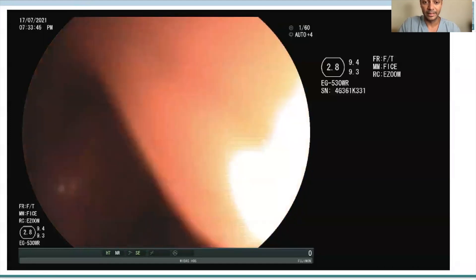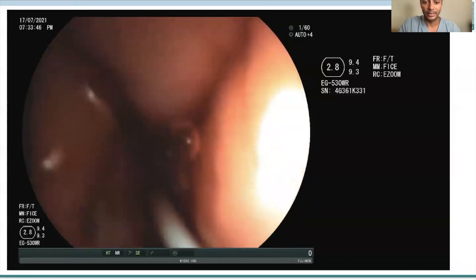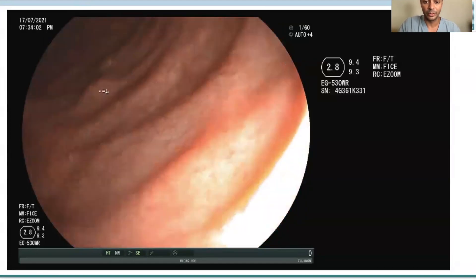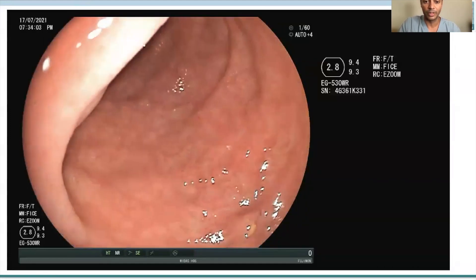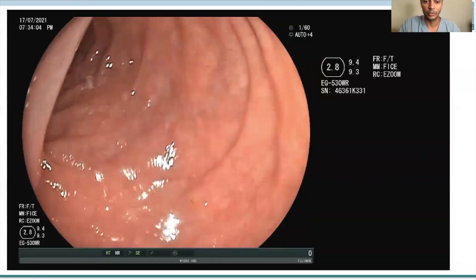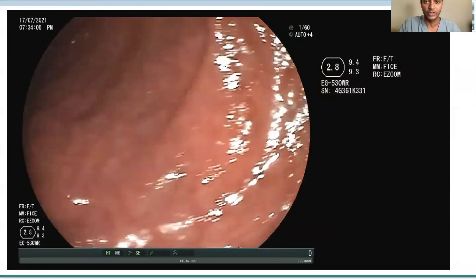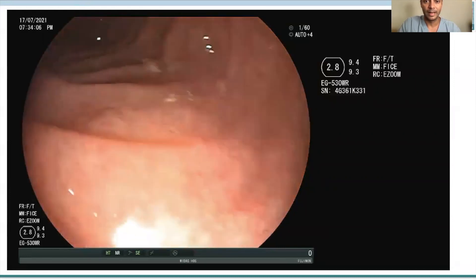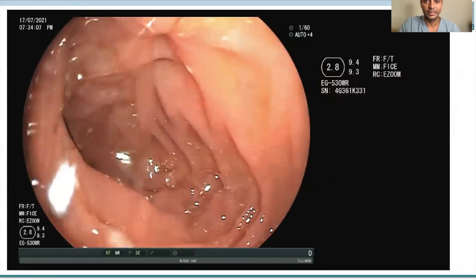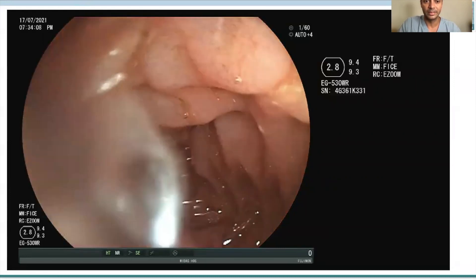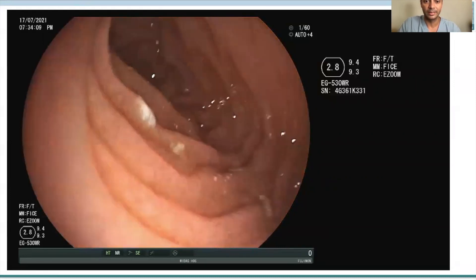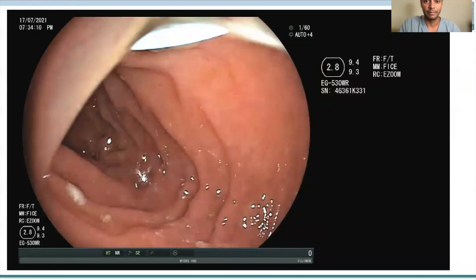Here the endoscope is being advanced into the duodenum. We used a small caliber scope which could be advanced across, and what we see is the stent coming out of the papilla.